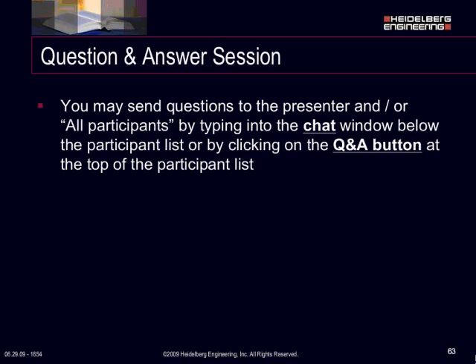And if you've got a nice good quality on the quality bar, you're okay. The vignetting on the corners may not be ideal, but we're dealing with real-world patients here. So as long as you've got good even illumination on the RPE and a good quality in the quality bar, you're okay. Thank you. And another question, is it possible to study the choroid on the Spectralis?